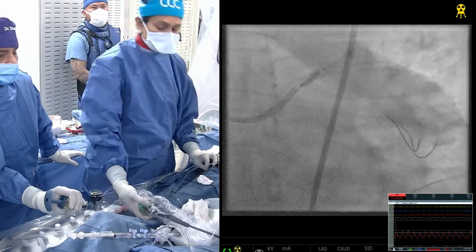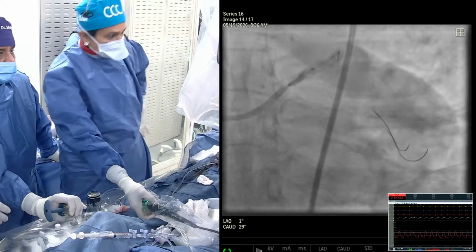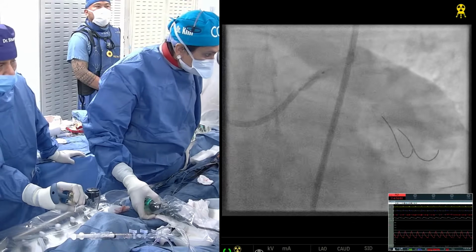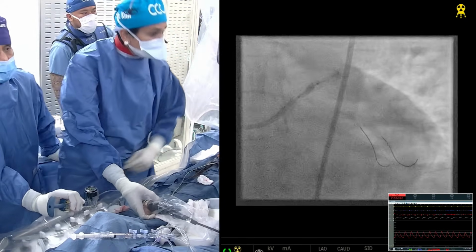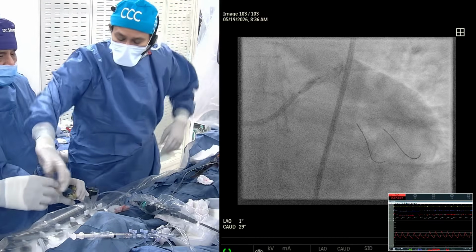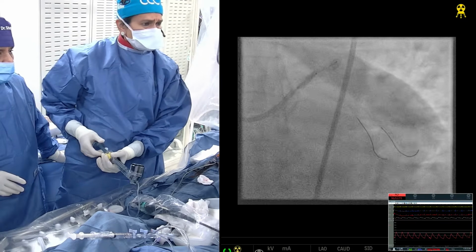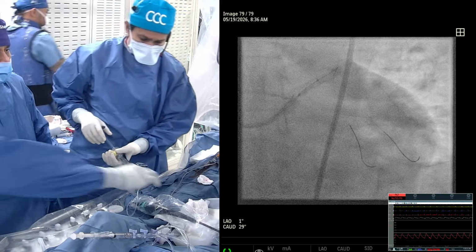Look at that. You can do an even bigger one. Remember I said 4-0? Now this is the Aero, the more flexible IVL catheter, which is very good, but we found a little more rupture of this because we remember the balloon material became thinner, and that is what we saw. You have to leave it for a few seconds. Yeah, good. So let's go back again.